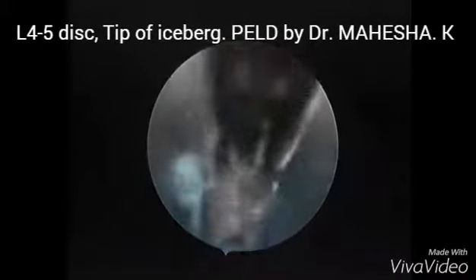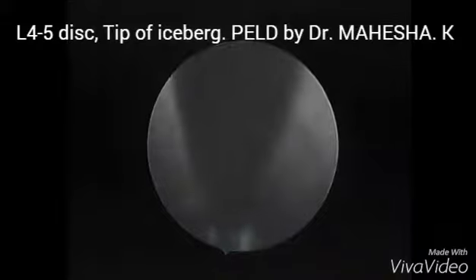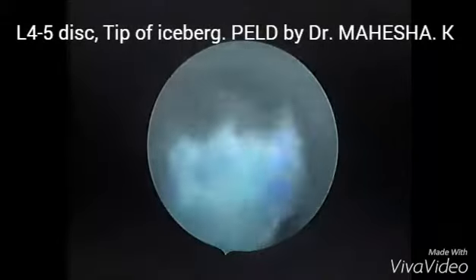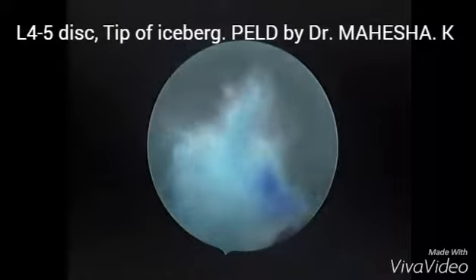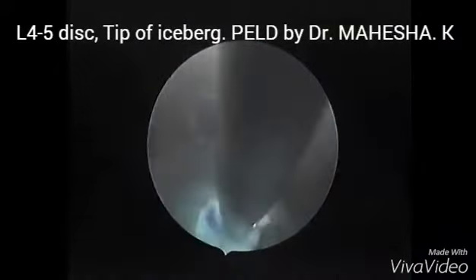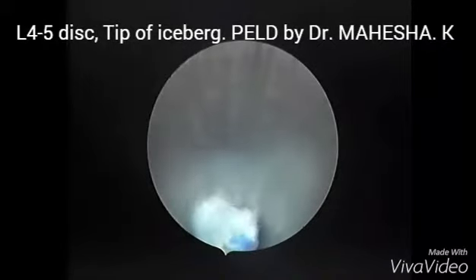I am trying to catch hold of this herniated fragment with disc forceps and remove it. But because the size of the fragment is big, it is not coming out easily. So what I need to do is change the disc forceps and then take it out.